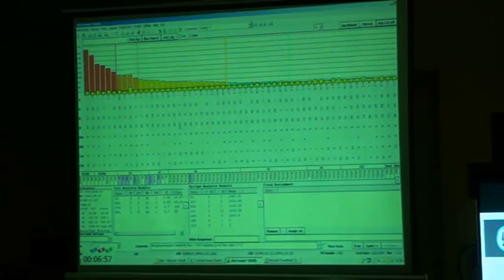How it looks: the y-axis gives the intensity of fluorescence, while the x-axis shows the different types of antigens present. It can give you the percentage of PRA positivity as well as the mean fluorescence intensity of each HLA antigen, positivity for each specific type, and can be used for class 1 and class 2.